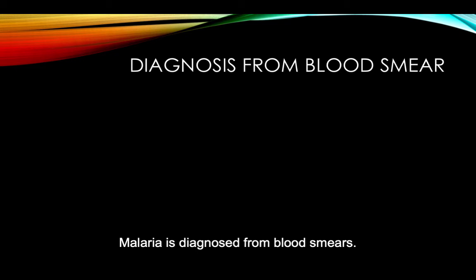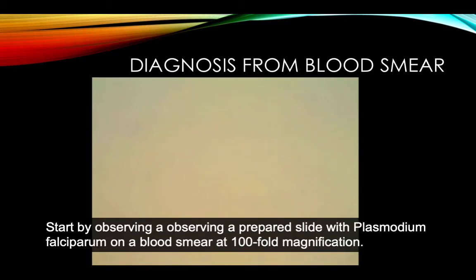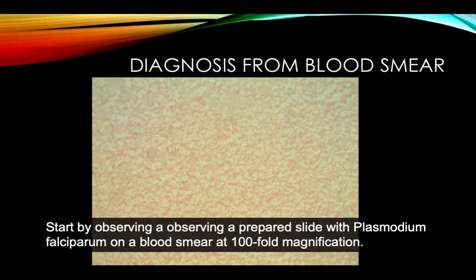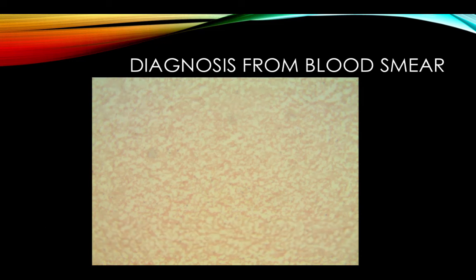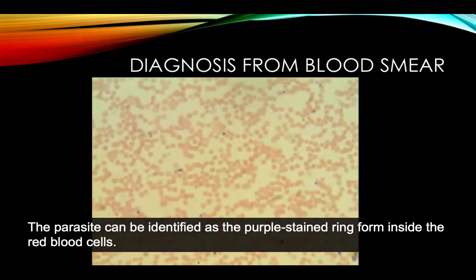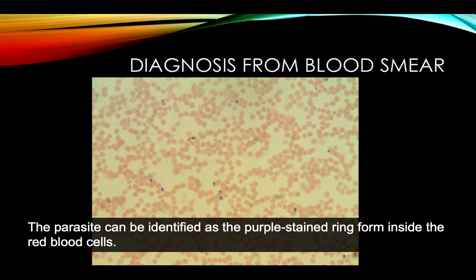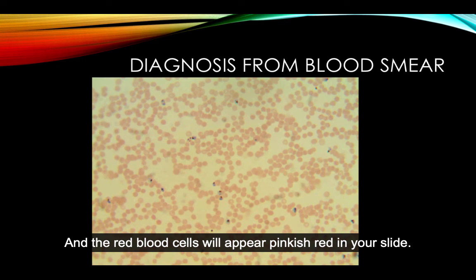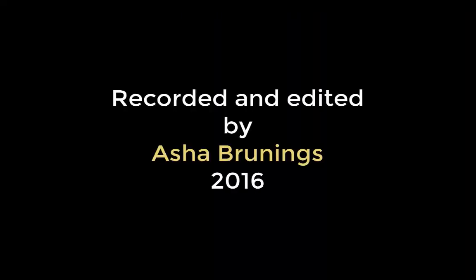Malaria is diagnosed from blood smears. Start by observing a prepared slide with Plasmodium falciparum on a blood smear at 100-fold magnification, then increase the magnification to 400-fold. The parasite can be identified as the purple stained ring form inside the red blood cells, and the red blood cells will appear pinkish-red in your slide.